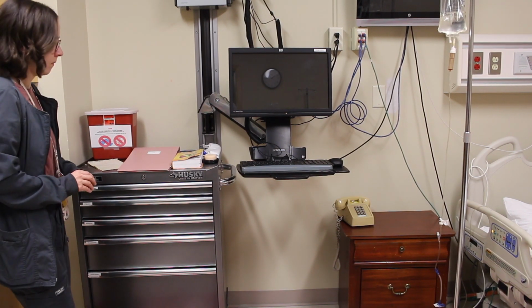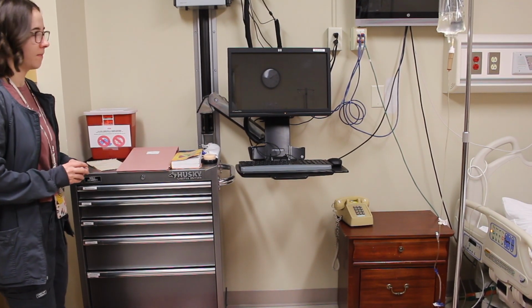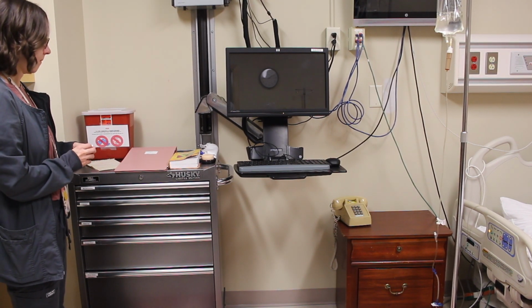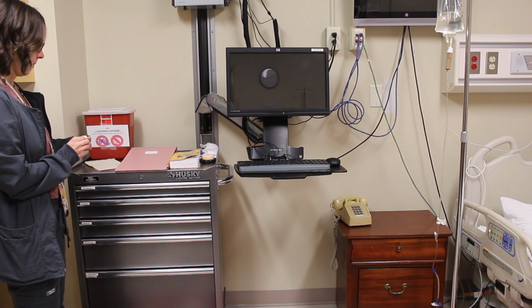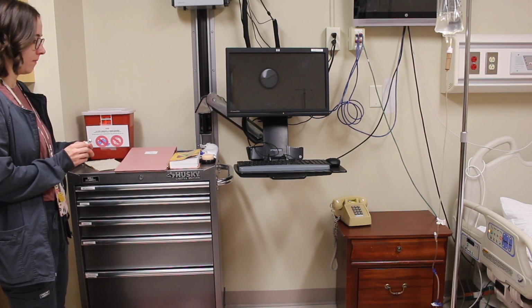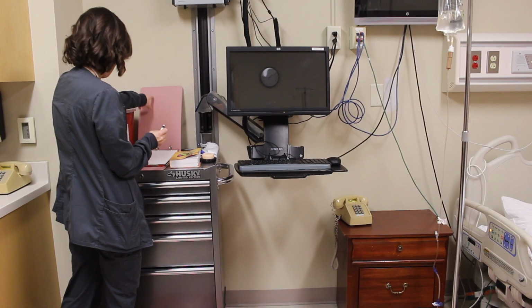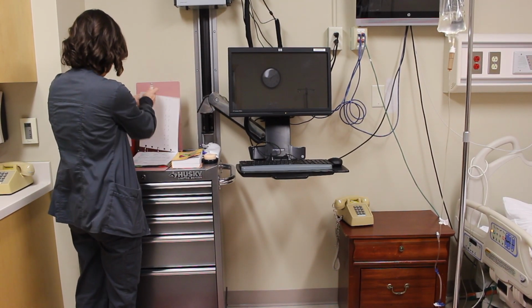This is the skill administering IV push medications. We will discuss administration through a primary IV line as well as through an intermittent device with extension tubing or IV lock. Complete all medication guidelines, including the 3 checks against the MAR and the 6 rights to medication administration.